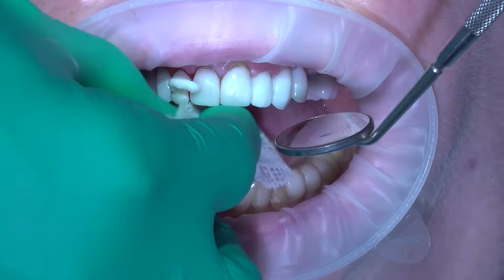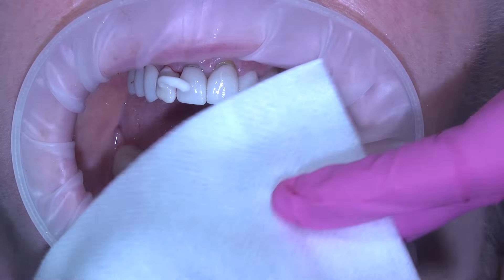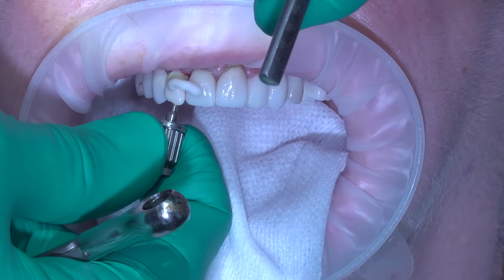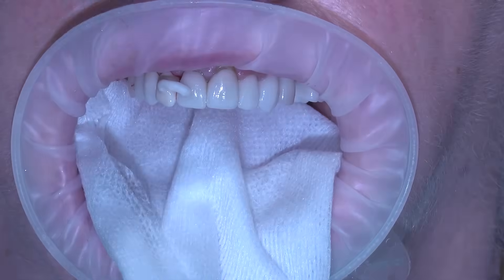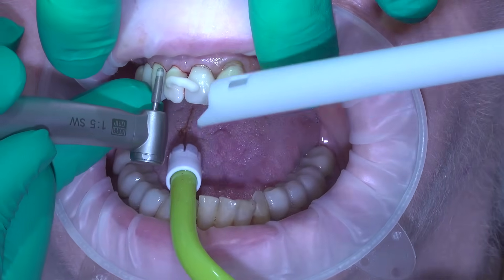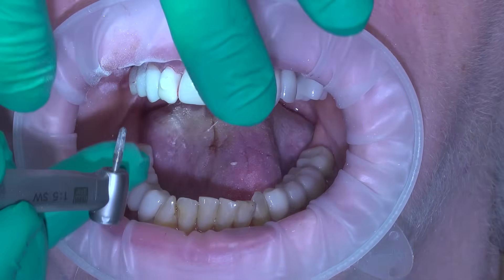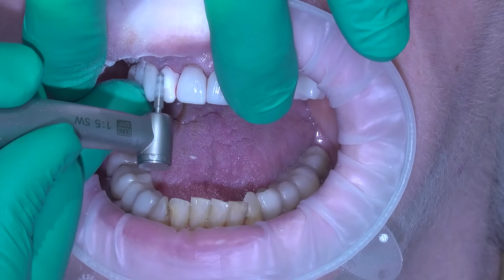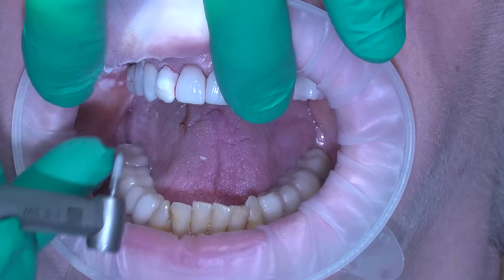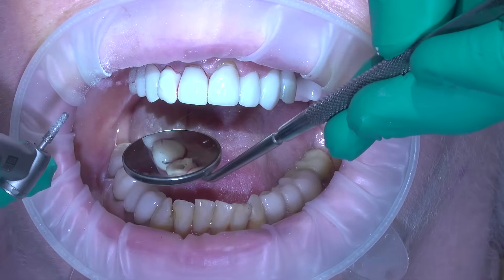It went right in and it's looking pretty good. The incisal edge looks a little wonky — we'll fix that in a minute. This is what it looks like from the occlusal view. Now you know why we call it the S-wings. Make sure if you're going to do this that your wings are oriented correctly — they need to be designed so that when you apply clockwise torque on your screw, it creates a counterclockwise anti-rotation force. If you put your S-wings on the wrong way, it doesn't help. We actually published a paper on this, and it's on my website, the Stanley Institute website, and it's free to download. So if you want to give that to your lab and try it, how-to instructions are on the website. Now just come in with your favorite burr — I like the big fat burr — and remove those little wings. One trick: never put your wings into the embrasures unless you want to spend a lot of time on modifications. Put it right smack dab in the center of the tooth — that way it's easy to clean up, polish, and make it look aesthetic.